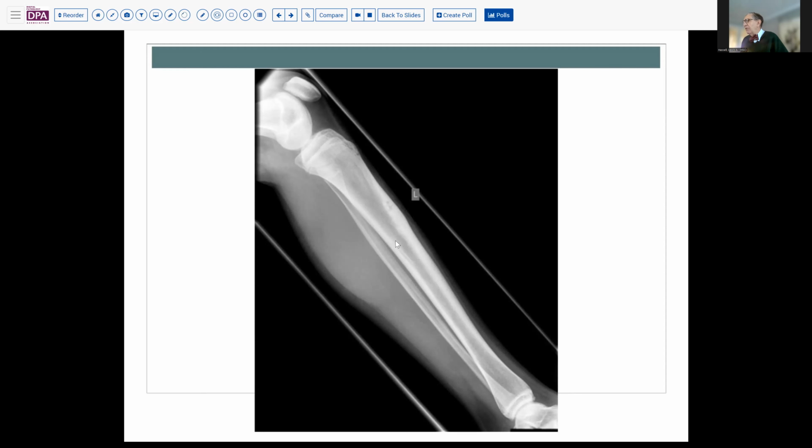But in an older patient, if it's discovered, of course, you'd have the differential of metastatic carcinoma and so forth. These epithelial cells that we pointed out are cytokeratin positive, EMA positive, also usually positive with P63, a squamous marker, as well.